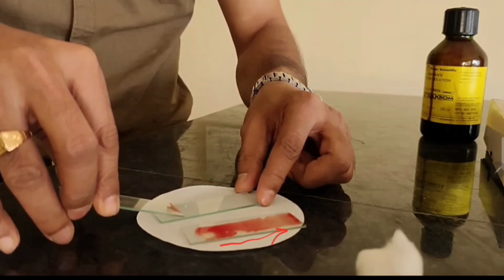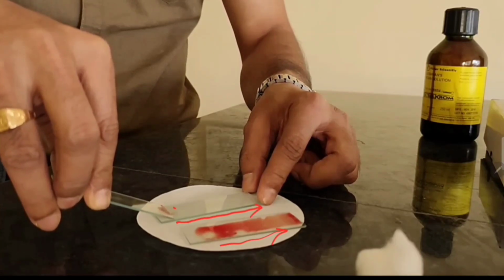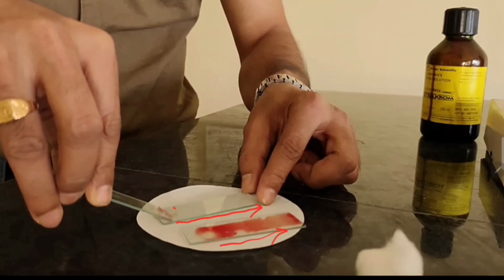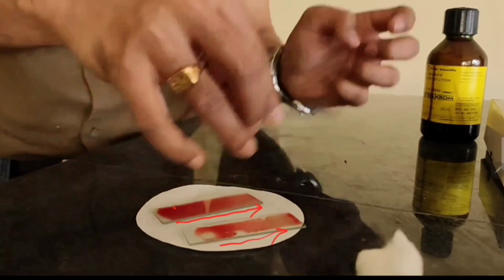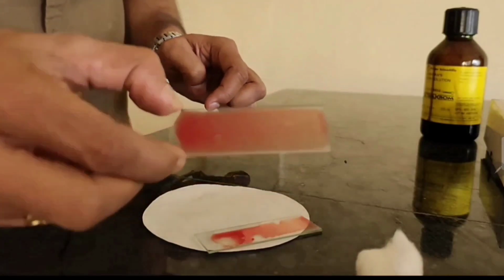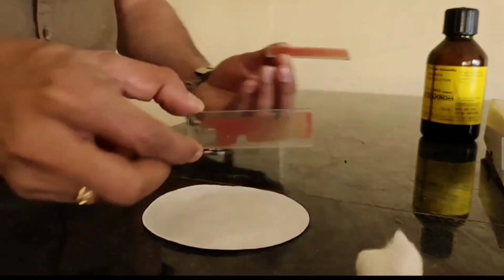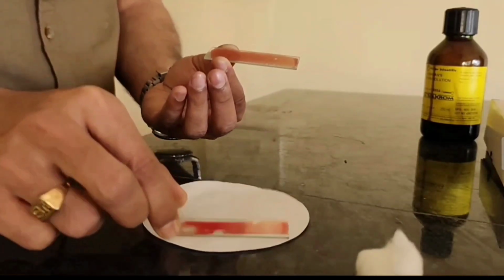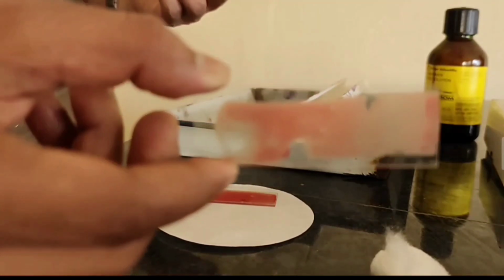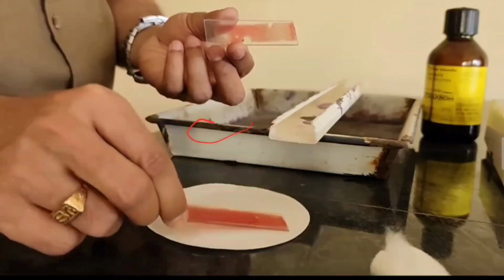See, I have turned it backward, it's going to spread, and in one go without stopping I have to do it. Allow the blood to spread completely. See, this blood film is prepared. This slide is good, you can see. And now we can move both slides to dry completely, air dry. So now the slide is prepared and it's already dry.